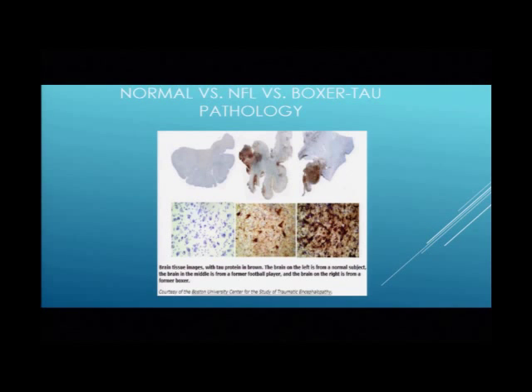So now we look at what happens to the brain when you have multiple concussions. And these are slides of the brain which are called pathology, or neuropathology to be specific. It's a section of the brain which is stained with a color. There are different colors. This is what the normal brain looks like on a gross level, and this is what it looks like microscopically. All those things that look like little triangles are nerve cells, and the lighter blue around it is the cytoplasm, and the white is the space, the parenchyma of the brain.